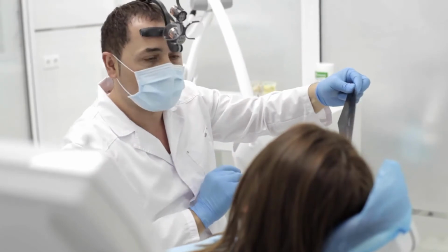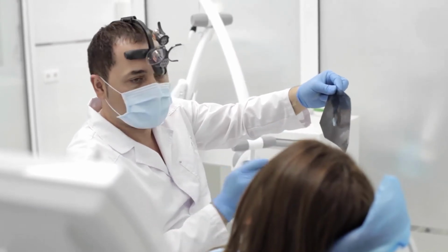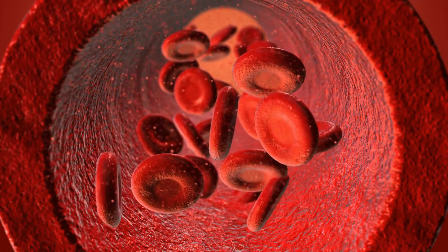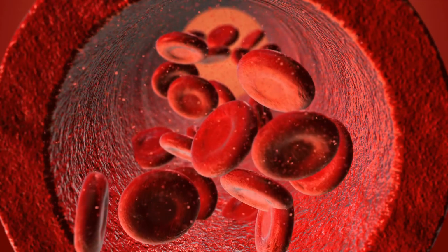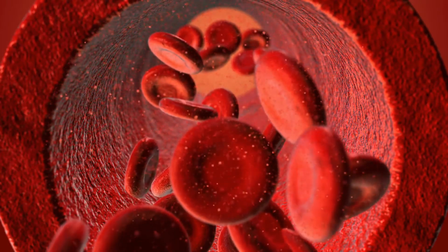the wave originated. Generally, when waves move towards the observer, the distance between waves shortens and the frequency at which waves occur increases. The opposite occurs as waves move away from an observer. How much the frequency and wavelength of sound waves is altered depends on how fast the object is moving. Measuring the change in wavelength and frequency can determine how fast the object is moving.